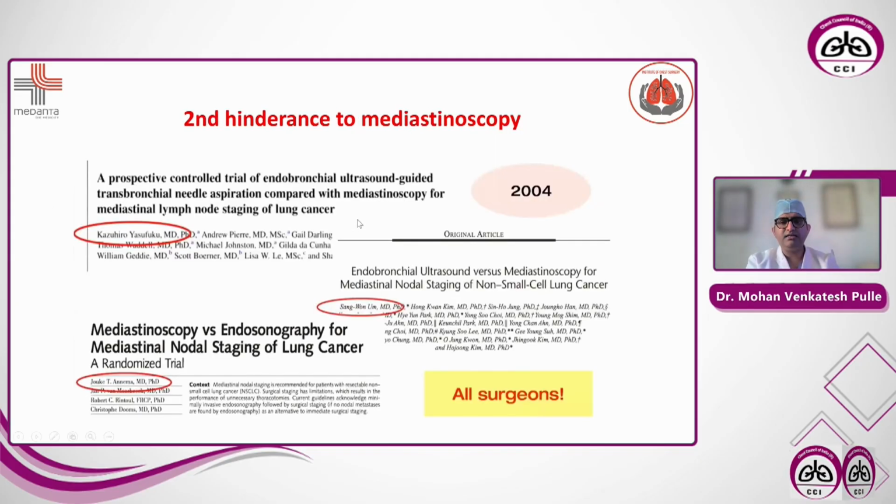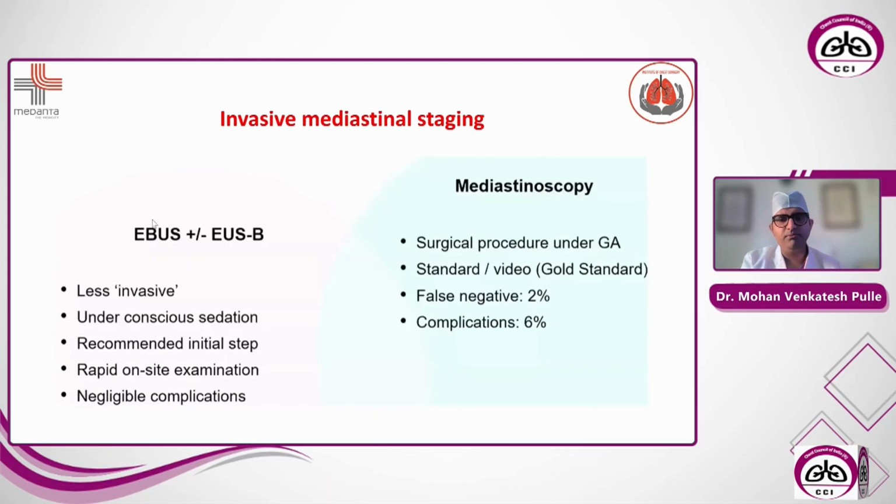So the second hindrance that came: all things are going well, and then EBUS has come into the picture, which was actually started by surgeons in 2004, and it has revolutionized mediastinal lymph node sampling. So the main difference between these two is that EBUS is definitely less invasive. It can be done under conscious sedation, is recommended as the initial step with all these advantages, and rapid onsite examination is possible with negligible complications.